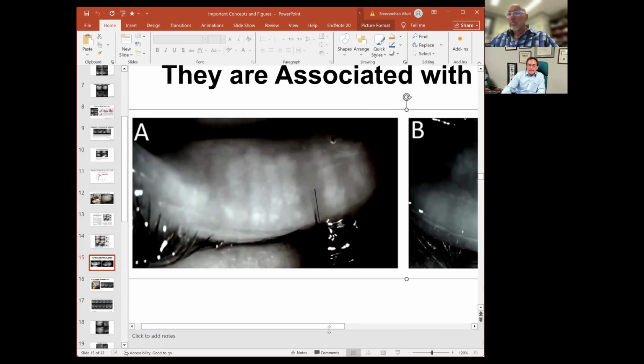I've placed a black line next to it so you can see the length of the probe. That probe is inside the central duct of basically an atrophic gland. You don't see any gland tissue, but it's there, because there's an orifice. If there's an orifice, there's a duct. If there's a duct, there very well may be, often is, if not usually, acinar epithelium, not sufficient enough to see on meibography, but sufficient enough to make oil. Very important. And B is another example of this.